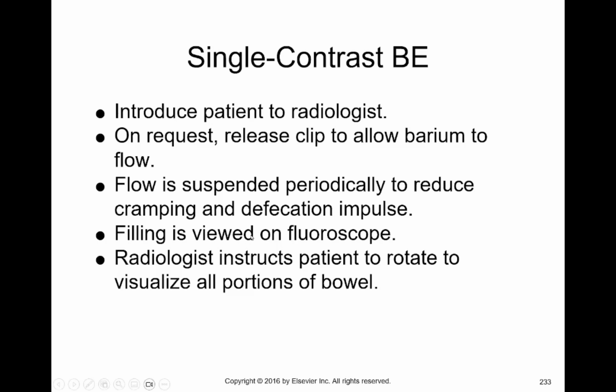Your part in the BE, be it single contrast or double contrast, is certainly to keep the patient comfortable and covered, and make sure the patient doesn't become uncovered.